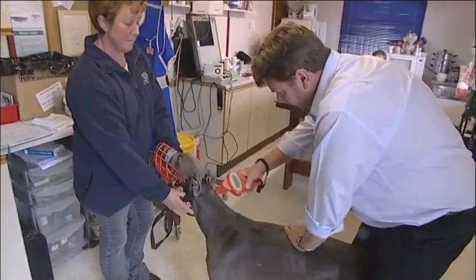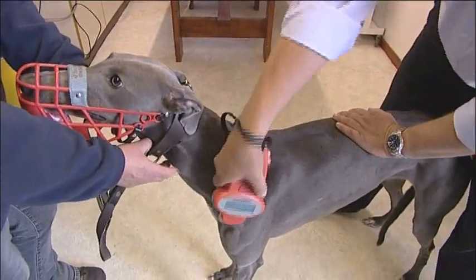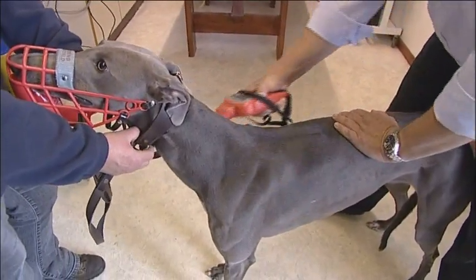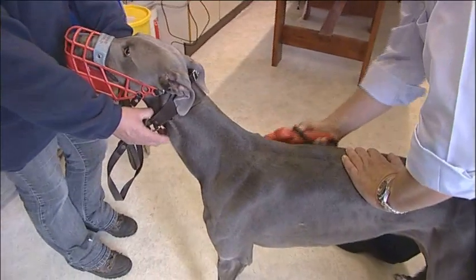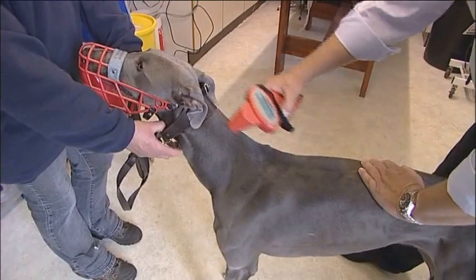The next step is to scan the greyhound using the handheld scanner to make sure that no chip is already in place. Switch the scanner on and move it in a rhythmic manner over the saddle area and the left and right neck and shoulder areas of the greyhound.